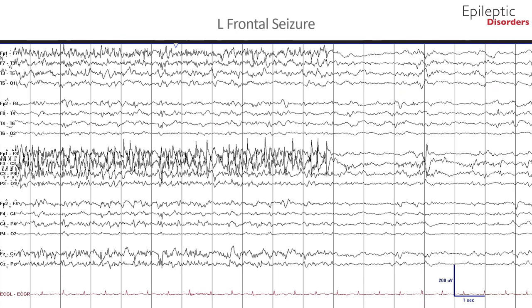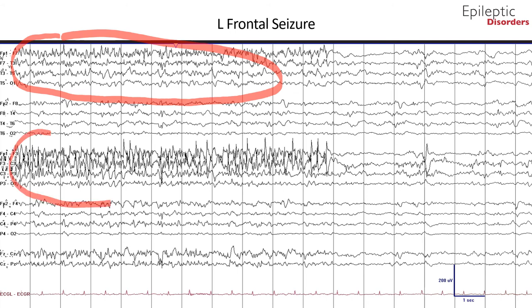In the second page of this seizure shown in bipolar montage, the left frontal sharps now occur at a consistent theta to alpha range frequency, outlined by the red circle. They have also spread to the left hemispheric regional channels including the temporal and central parietal region.